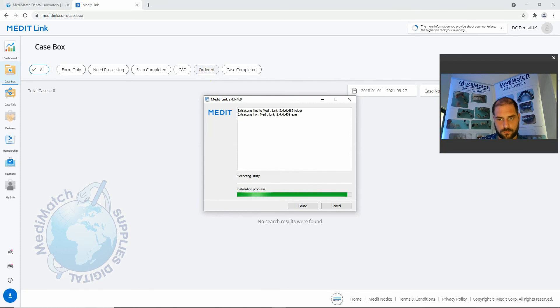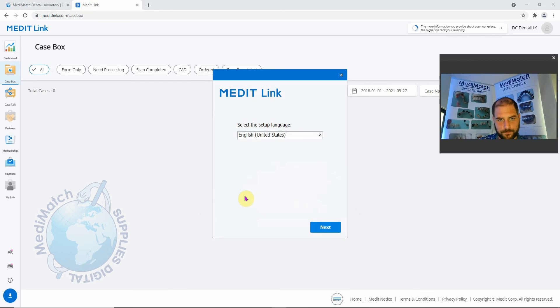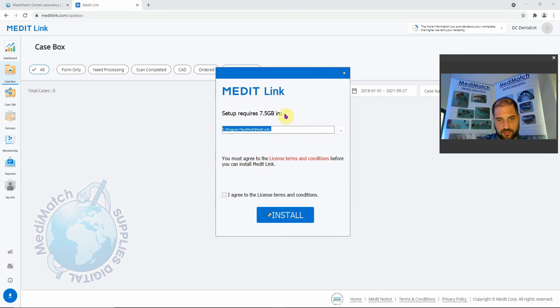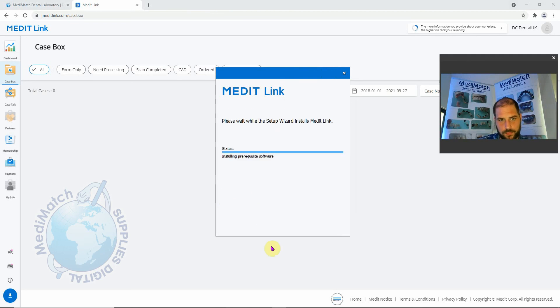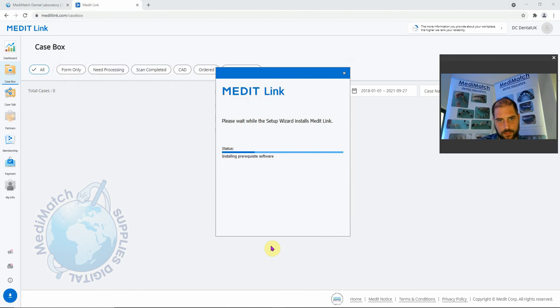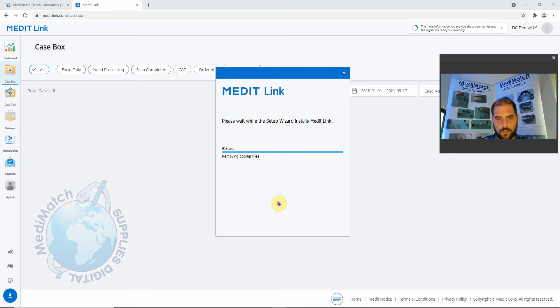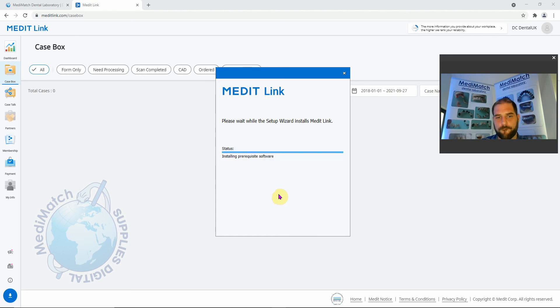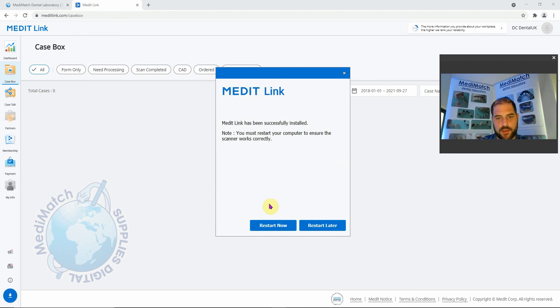We'll click yes here. Select your language. The setup requires an additional 7.5 gig. Agree. We now need to restart our system to make sure everything works correctly. So we'll go ahead and do this.